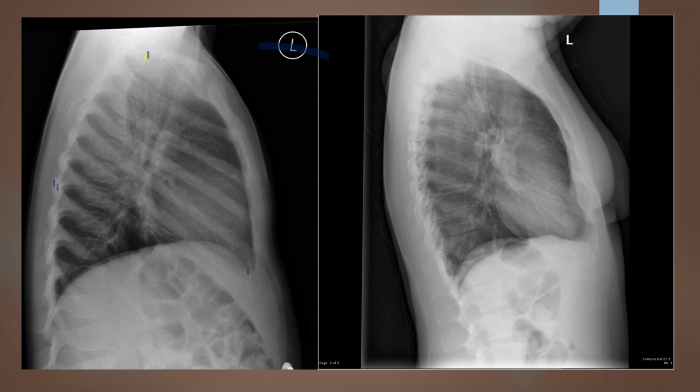If I had a bad mid-coronal tilt, we would see the patient across our image like this. We do not see that. They seem pretty vertical, so we know that mid-coronal is in line with the long axis of the IR, so that's a good thing. Passes another check.